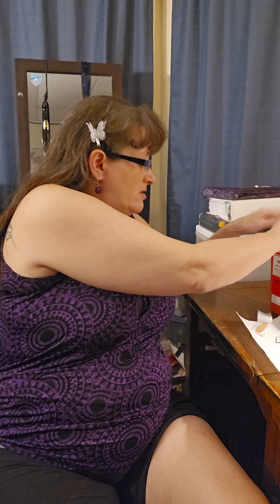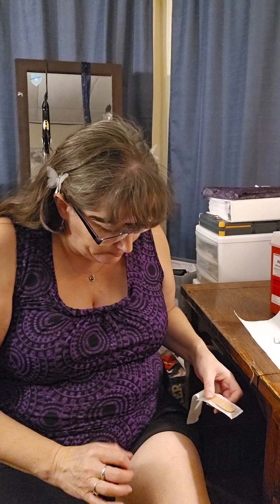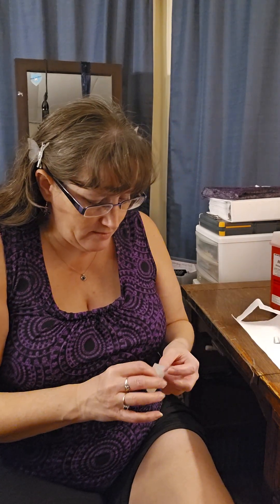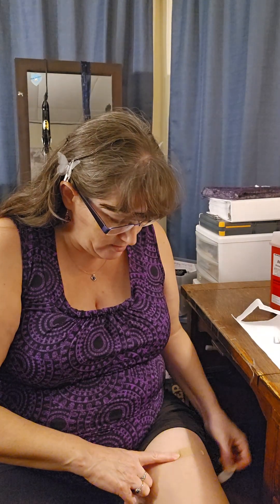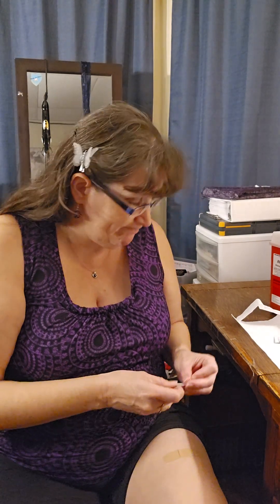It's out in the sharps. Dupixent stings like a son of a bitch. Ouch. This is not the right band-aid but whatever. Let's hope it works better than last time — I misfired it really bad. Thanks.